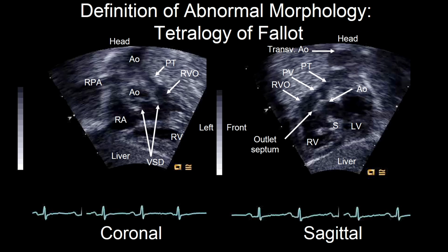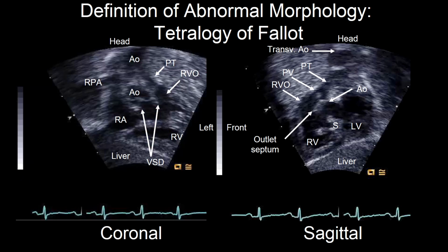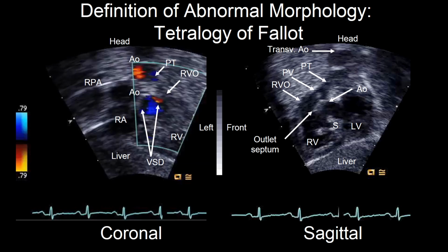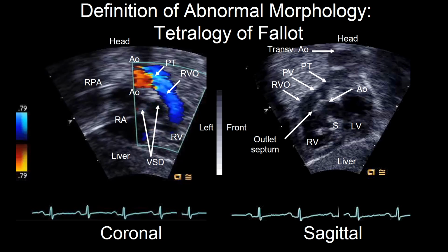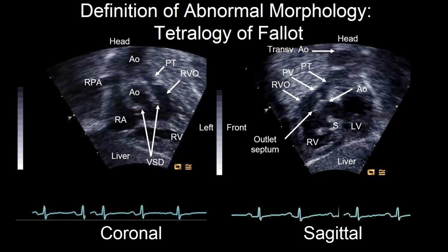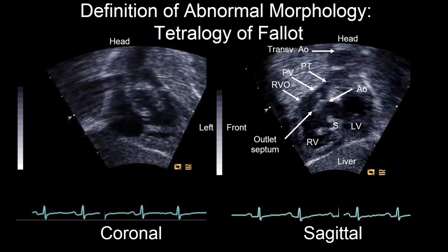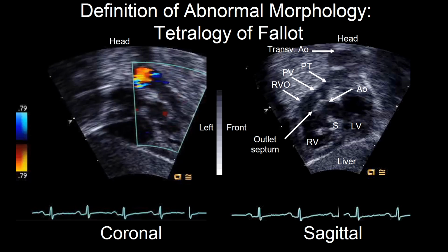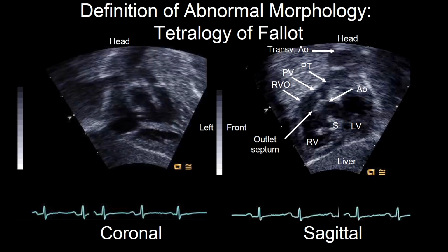And the morphology is somewhat better than it has been in the past. And the developments that have added to our understanding and thrill have been the use of Doppler color flow imaging, which can be superimposed upon the image. There's one frame with color and one frame without color, and you can see the narrowing within the right ventricular outflow tract. I'll take the labels off so that you can see that. And also there's a yellow signal within the pulmonary artery representing a patent ductus arteriosus.